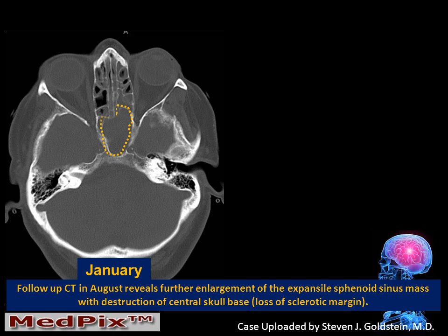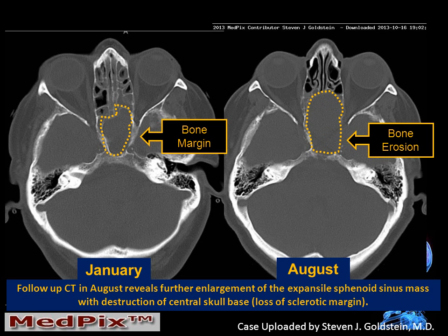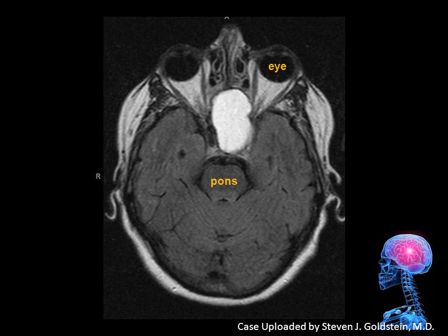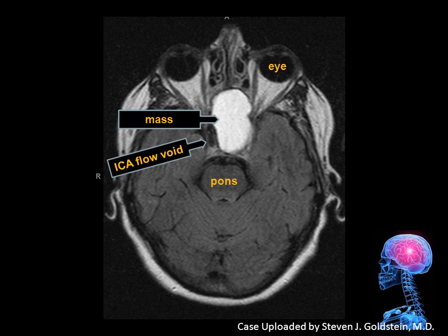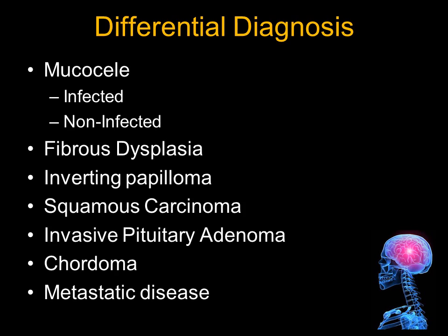If we carefully compare the original image from January, we can see the bone margin. But looking at the current image from August, the mass has now expanded and we have lost the bony detail of the lateral margin on the left side. On the MR, we can see the mass with fluid signal. We can also see the internal carotid flow void in the cavernous sinus — a normal appearance on the right side — but we do not see a corresponding carotid flow void on the left side, and we have lost the sclerotic bone margin.